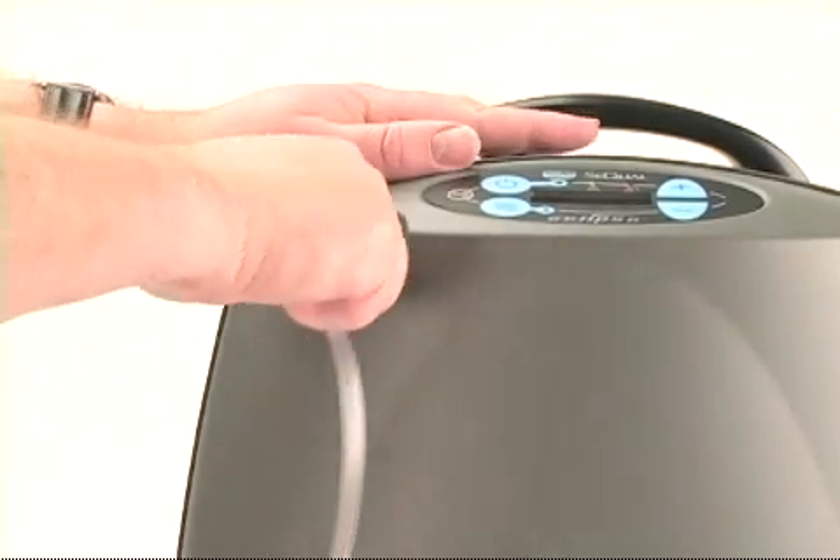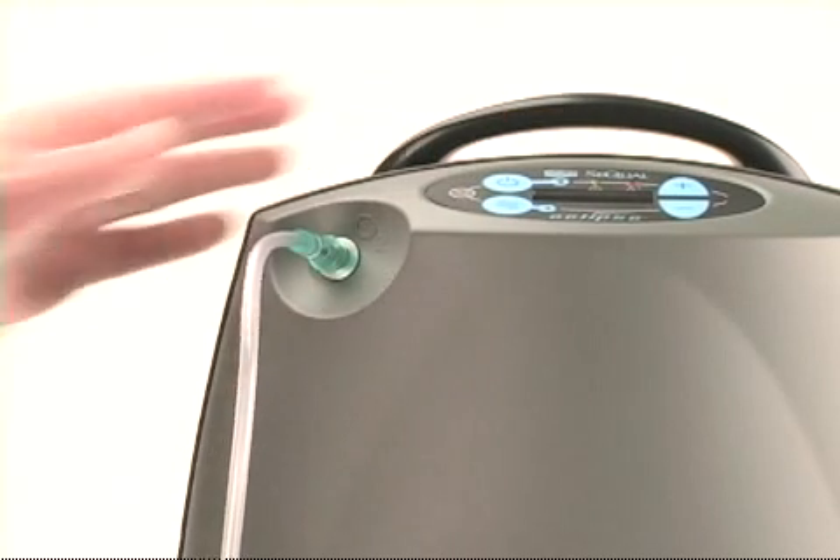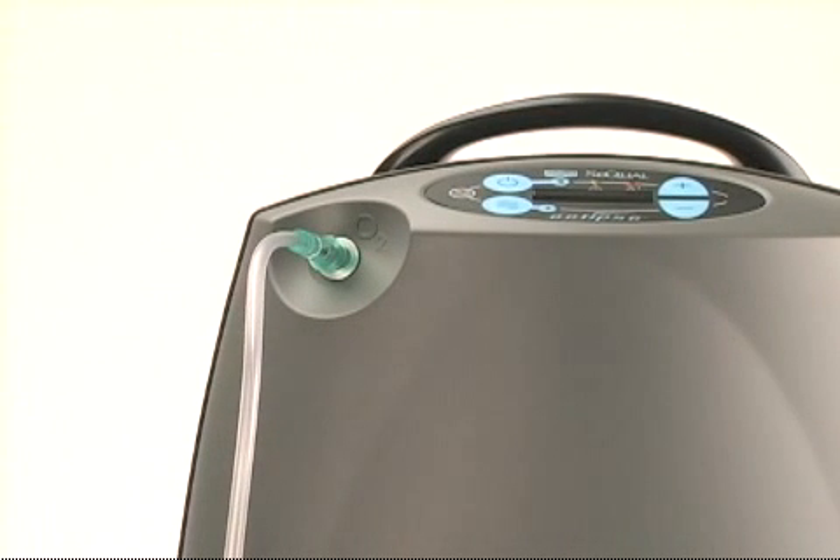You should replace your cannula and oxygen supply tubing on a regular basis. Your doctor or home care provider can best establish a suitable schedule for the replacement of these items.